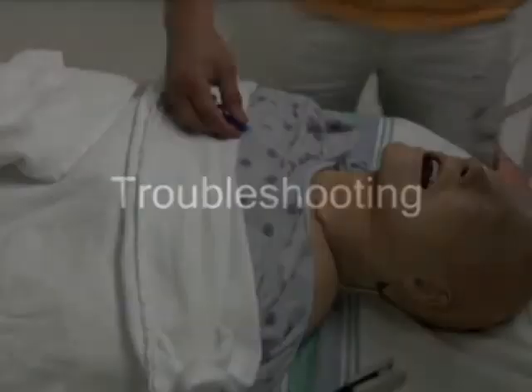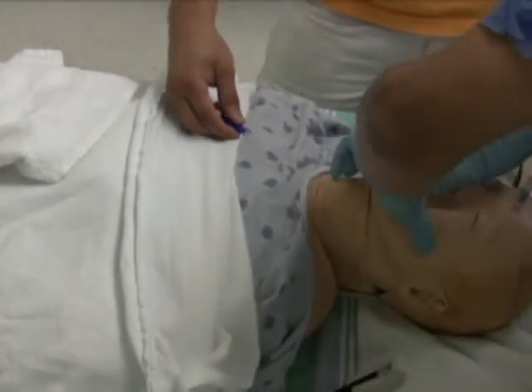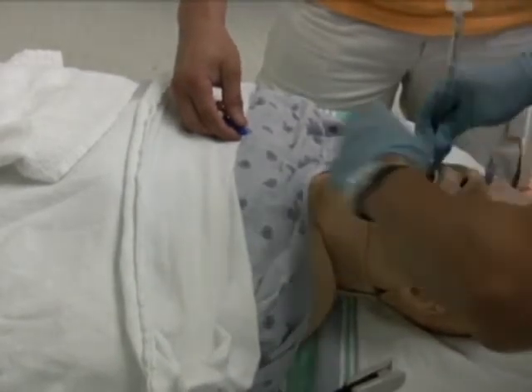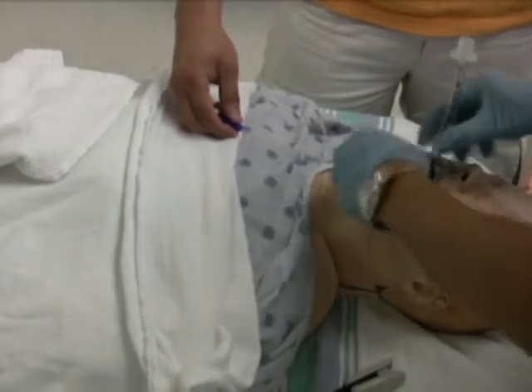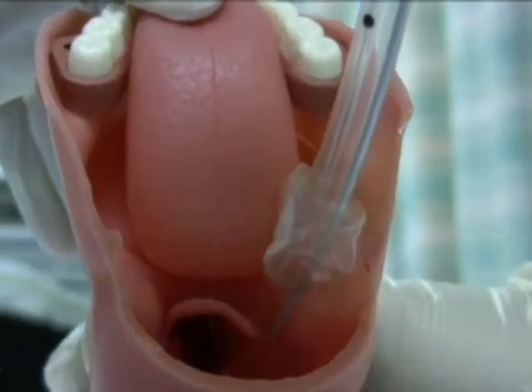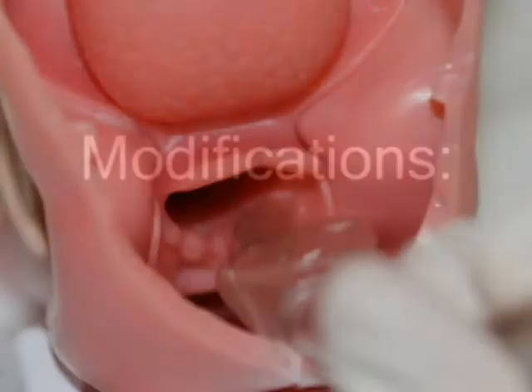One of the difficulties with retrograde intubation is the inability to locate the tip of the tracheal tube when it is advanced to the cricothyroid membrane in the trachea. In some situations, resistance is felt while advancing the tube into the glottis when the tip of the tube catches soft tissues such as the epiglottis, vallecula, or the arytenoids. To prevent removing the epidural catheter or guide wire prematurely and to improve the success rate, a number of modifications have been suggested.